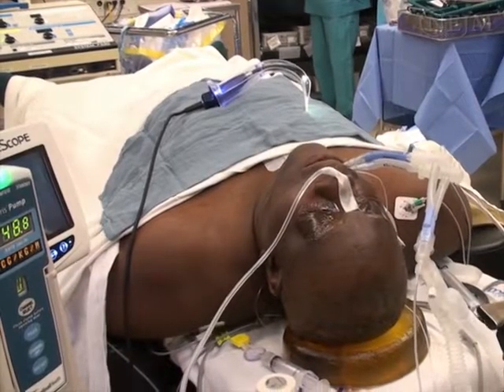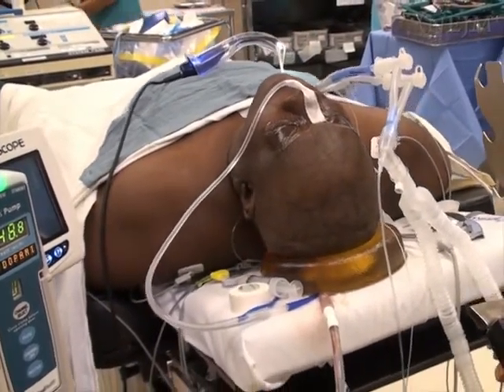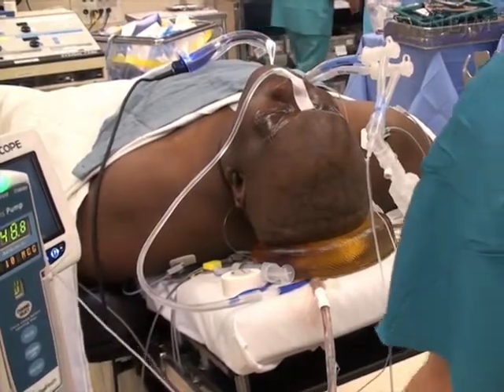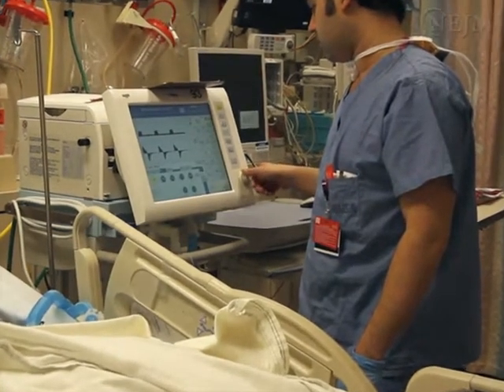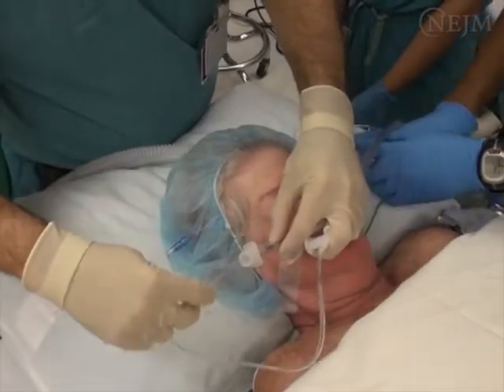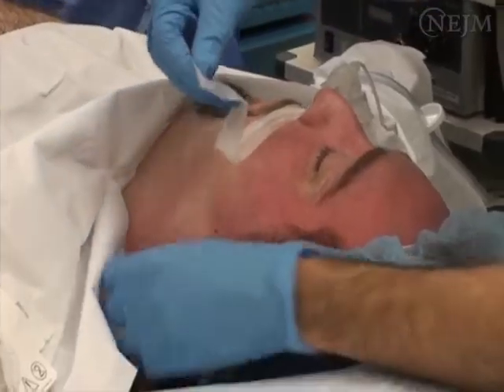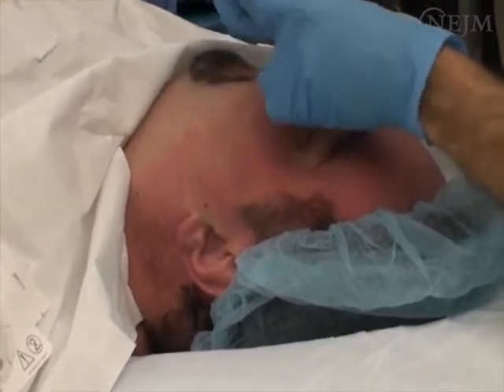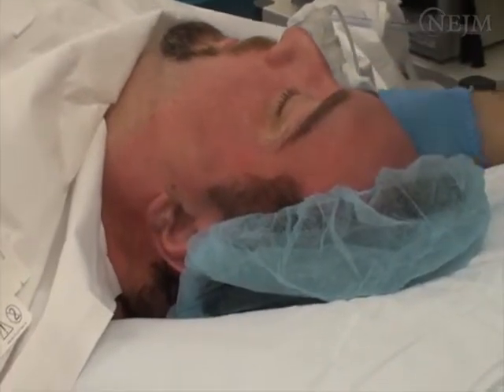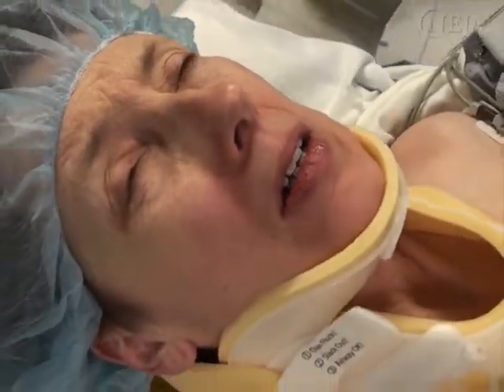Place the patient in a semi-recumbent position to reduce the work of breathing and improve oxygenation. An upright position increases functional residual capacity, allowing for longer periods of apnea before oxygen desaturation occurs. Make sure that the tidal volume, respiratory rate, and inspiratory force are at appropriate levels before beginning extubation. Suction the patient's endotracheal tube using a disposable catheter or an inline suction device, and then carefully remove any tape or securing device in preparation for extubation. Avoid inducing abrupt head and neck movements, which may cause the endotracheal tube to stimulate the trachea and trigger coughing. A patient with an injury to the cervical spine may require additional neck support.